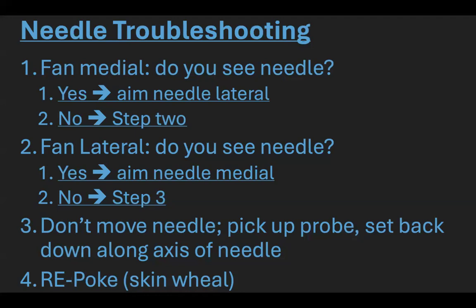And then one other thing I've found helpful is, if you can't find your needle, picking up the probe, completely removing it from the patient, and setting it along the axis of that needle to figure out where your needle is relative to the target structure. I've also found that to be helpful.